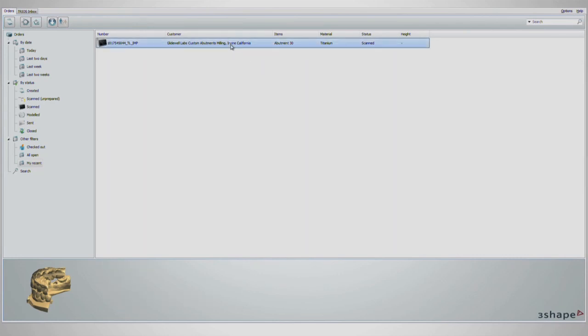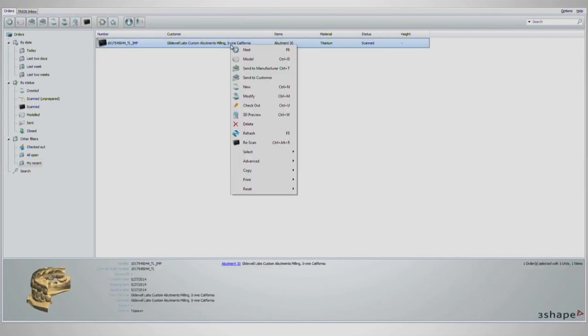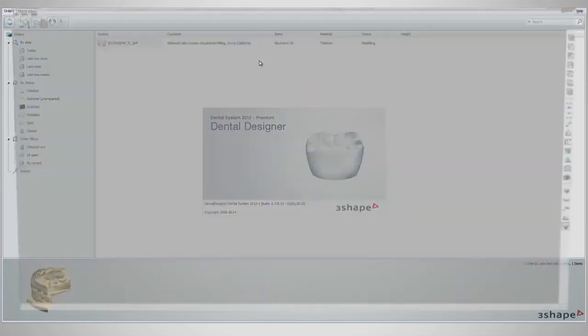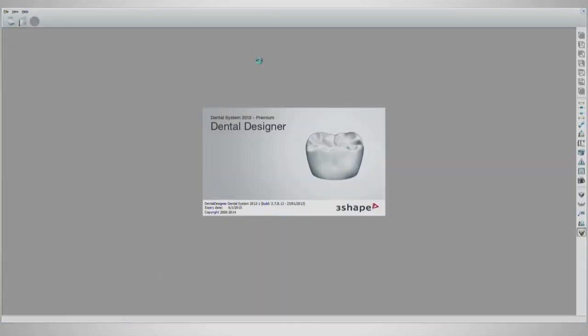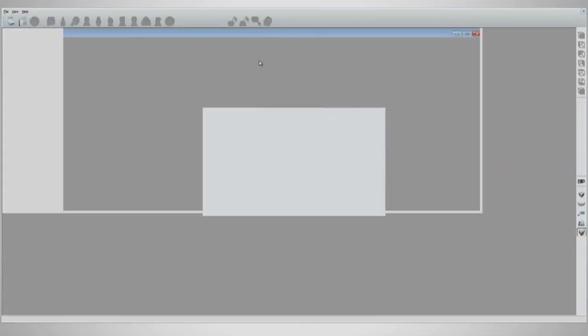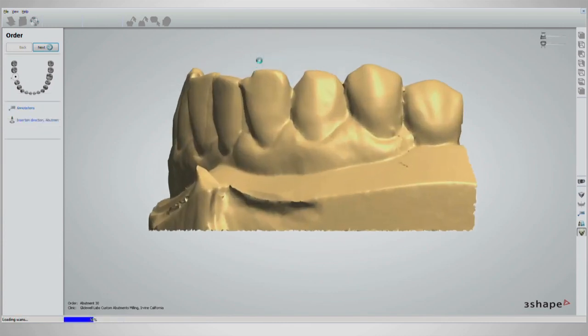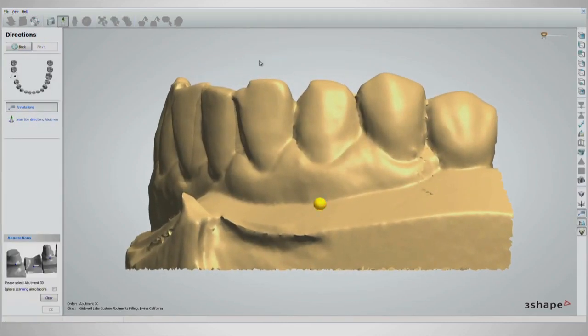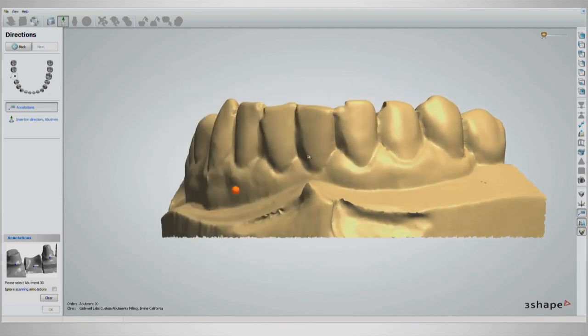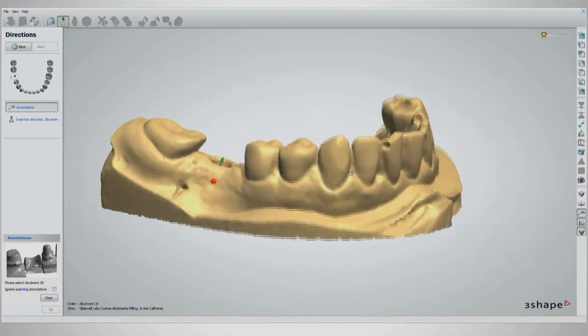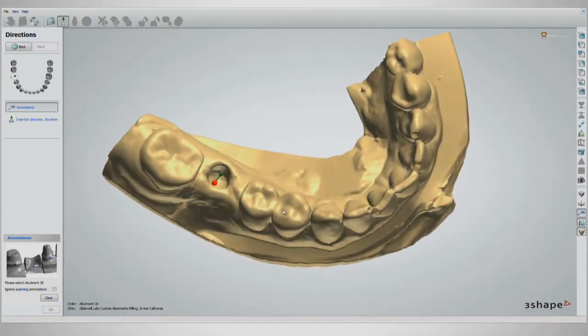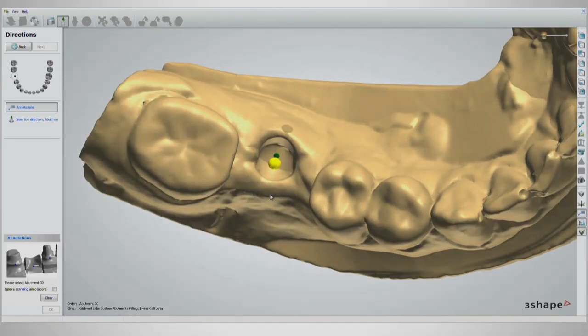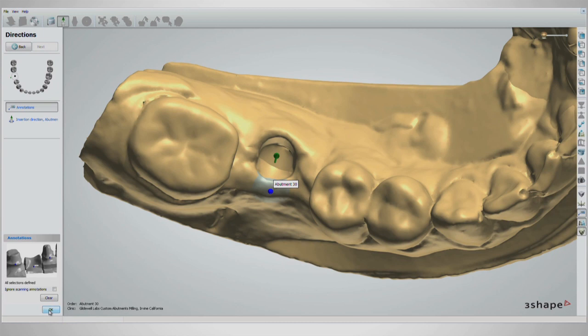Return to the file and right-click, then select Model. This will open the design stage of the program. The scan model will appear, as well as a glowing orb for every implant. Here we only have one. All that is needed here is to left-click on the buccal tissue at the implant site, then click OK on the bottom left.